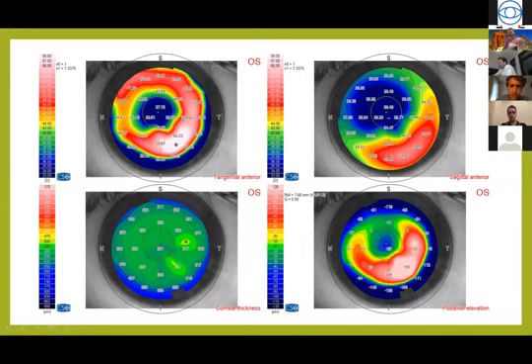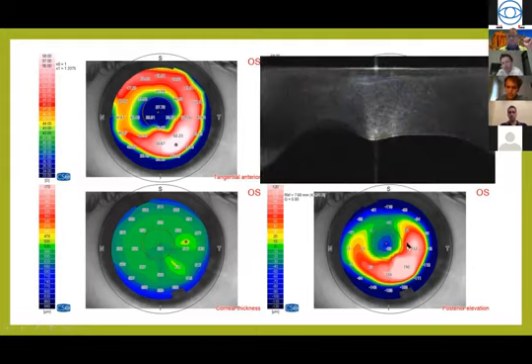So basically in RK you have this donut shape in the anterior and the posterior surface, because in LASIK you only get it on the anterior surface, but never on the posterior surface, unless you have a post-LASIK ectasia, okay? But here you have this donut on the anterior and the posterior with no loss of tissue, okay? But here now with the anamorphic image, you can not only see the map, the color map, but also understand how in the area of the keratotomy, the posterior cornea is becoming elevated, okay? And then you can directly see this posterior elevation in real.